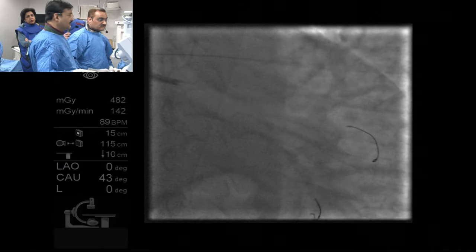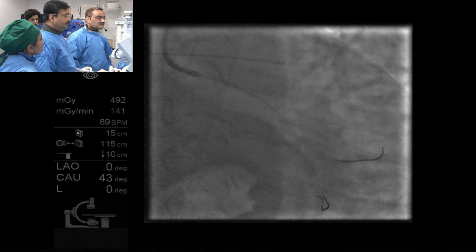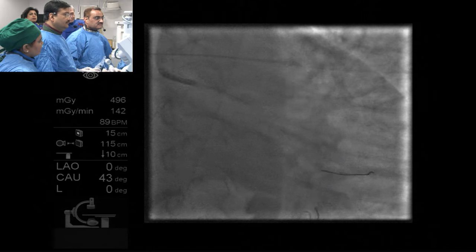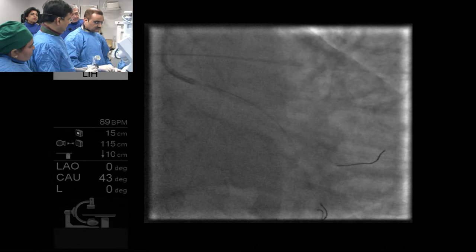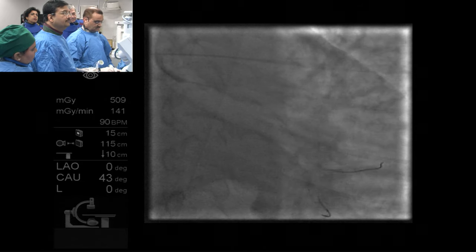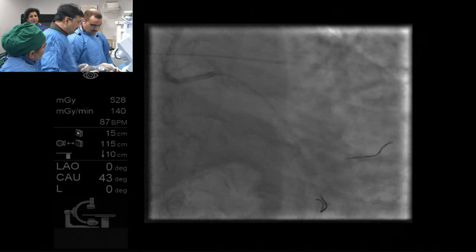Tech, do you want to describe in-stent restenosis? I can deal with it later on. See why I went like this. I hope there is no perforation issue. No. Okay. Guiding. What balloon was that other one? 2 by 15. No, but what is that? Which company?